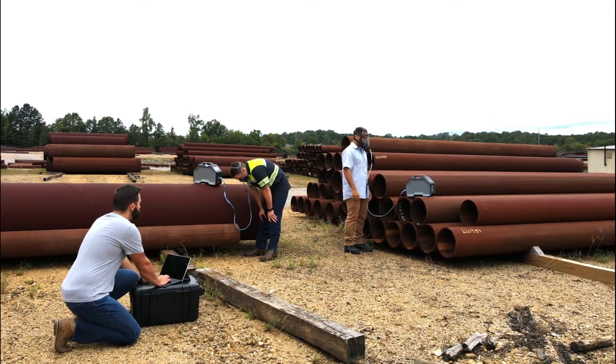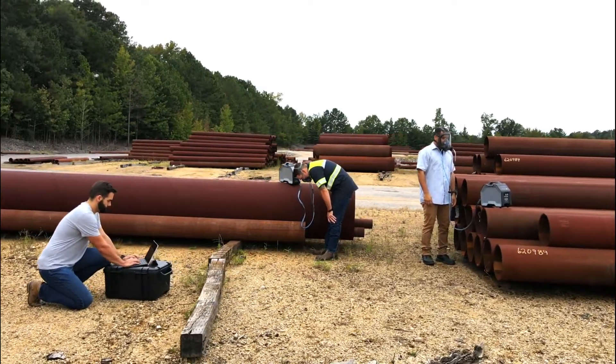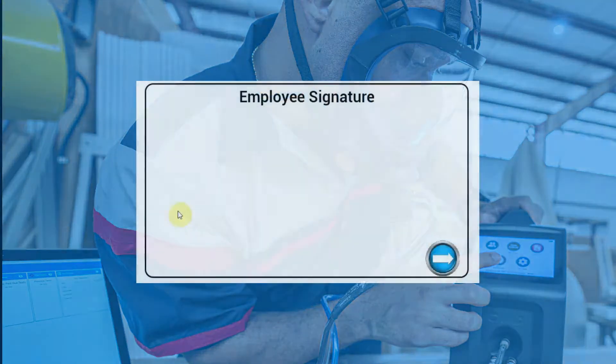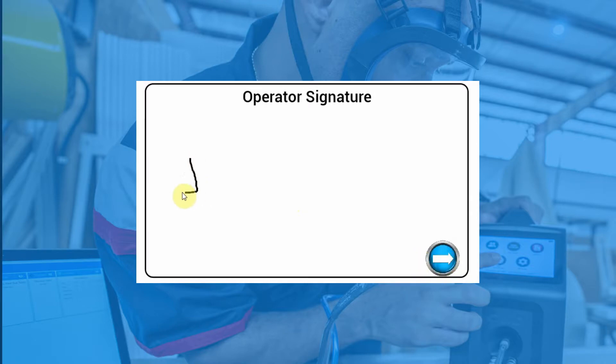The Quantifit 2 also has the capabilities to test countless individuals simultaneously with the use of Logic software. Upon completion of the test, utilise the on-screen signature capture to easily obtain and store operator and test subject signatures for enhanced test validation and record keeping.